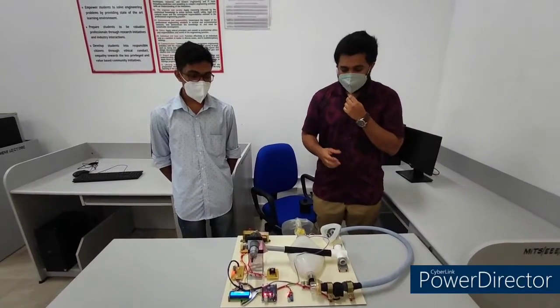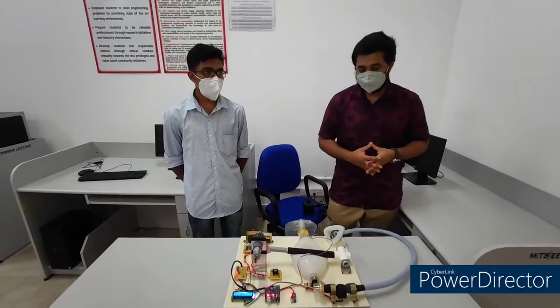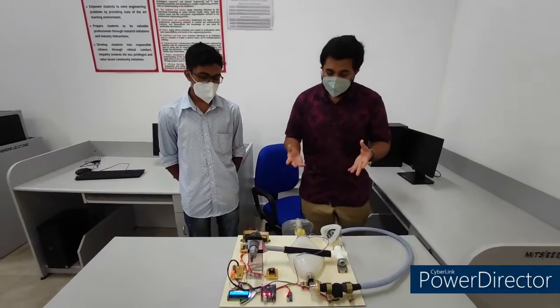We have also been selected for publishing a paper in the Ayrton region conference, conducted virtually in Bangalore. Coming to the topic, the Low Cost Portable Ventilator is much more relevant in this scenario because we are facing a pandemic like COVID-19, where most patients are critically affected with acute respiratory diseases.